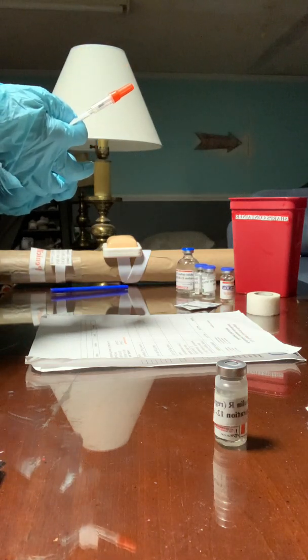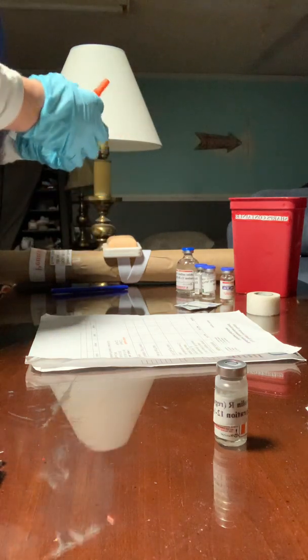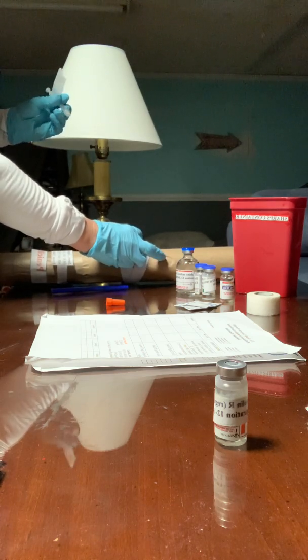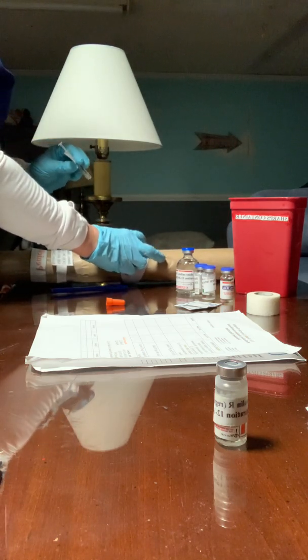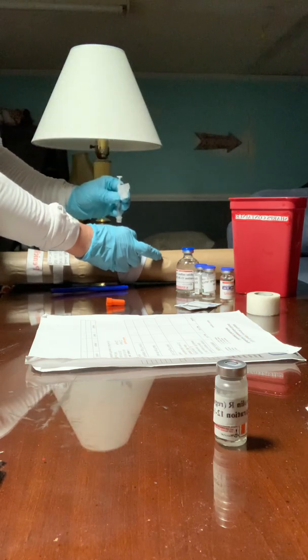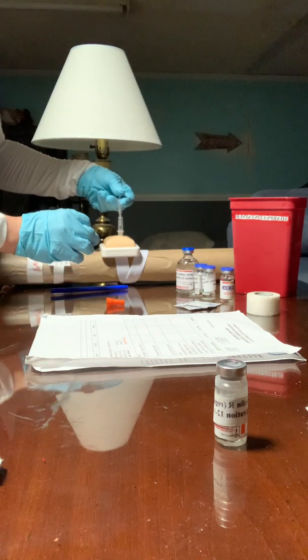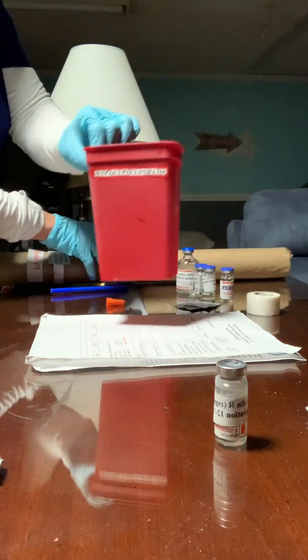Next, I will assess for a proper injection site. In the injection site, I'm looking for any bruising, edema, or tenderness. Because this is a subcutaneous injection, I'm going to be pinching the skin. If I could pinch 1 inch, I would go in at a 45-degree angle. Pinching 2 inches, I will go in at a 90-degree angle. Because I pinched 2 inches, I will go in at 90 degrees. Then I would release, inject slowly, then pull out and put slight pressure. I will discard my syringe into the sharps container.